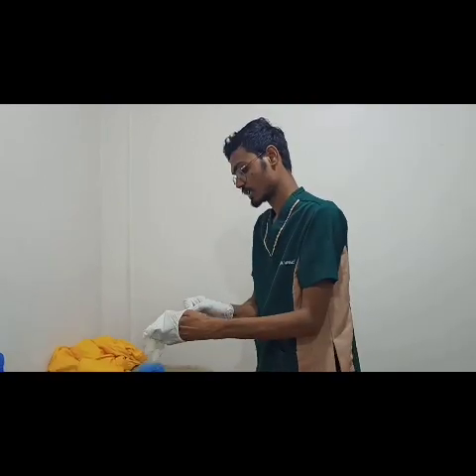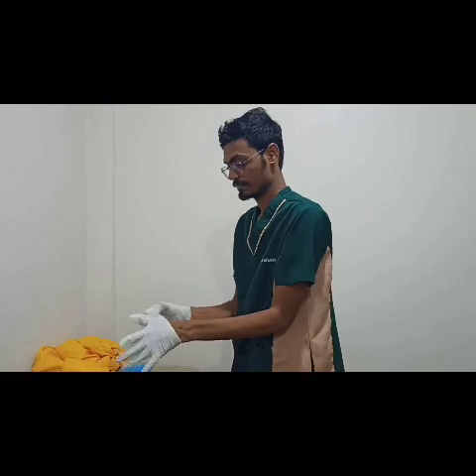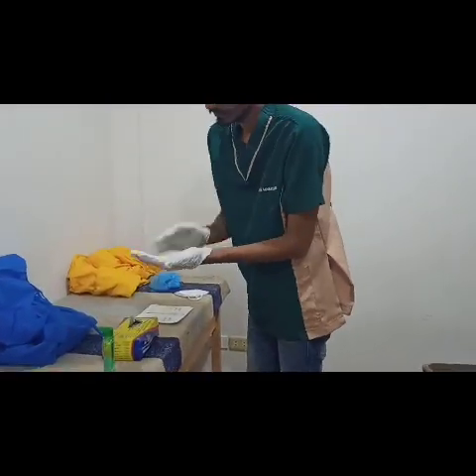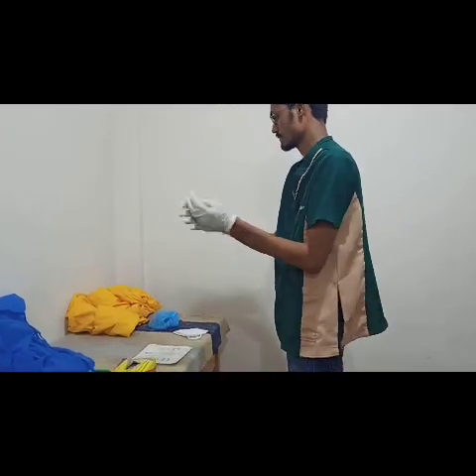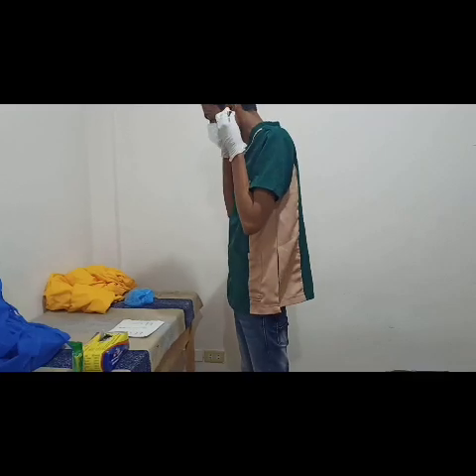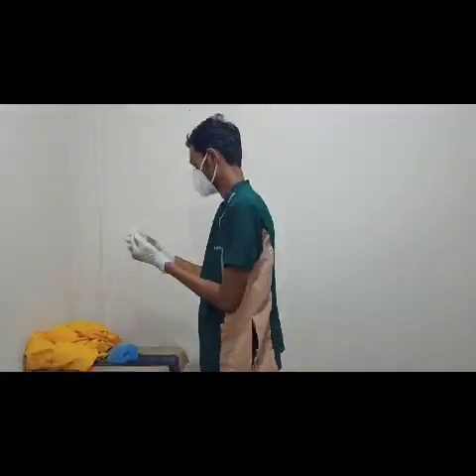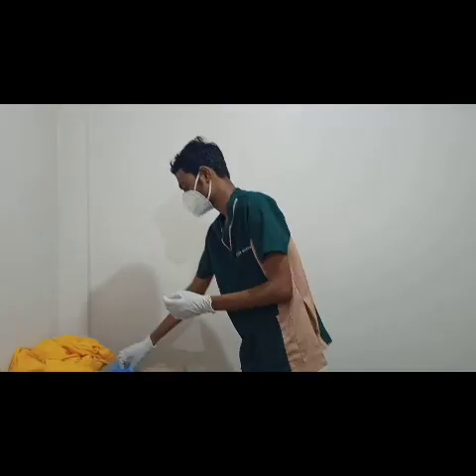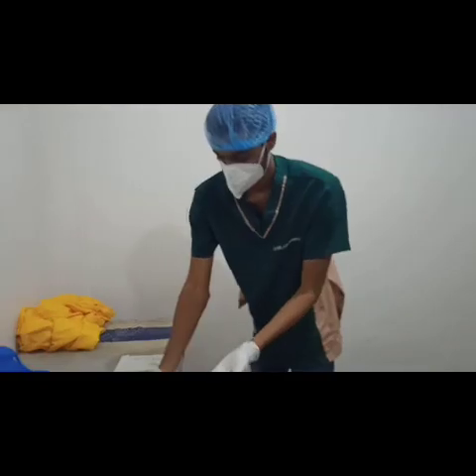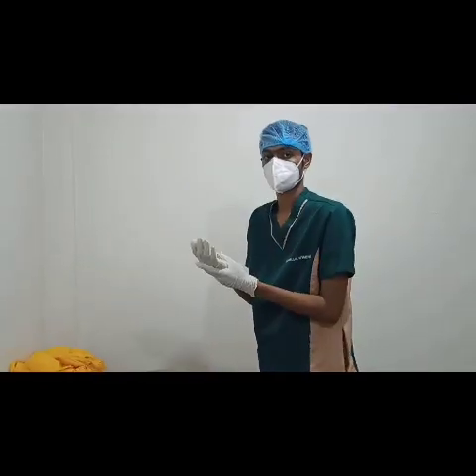Now first we are going to wear non-sterile gloves and sanitize your hands. Now going to wear a face mask. Sanitize your hands. And now I am going to wear head cap and sanitize your hands again. Now I am going to wear the PPE.